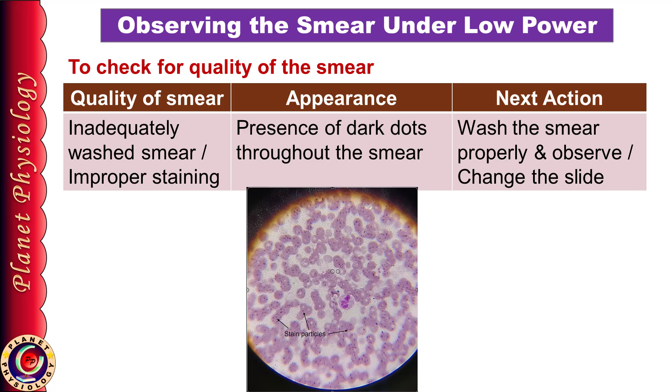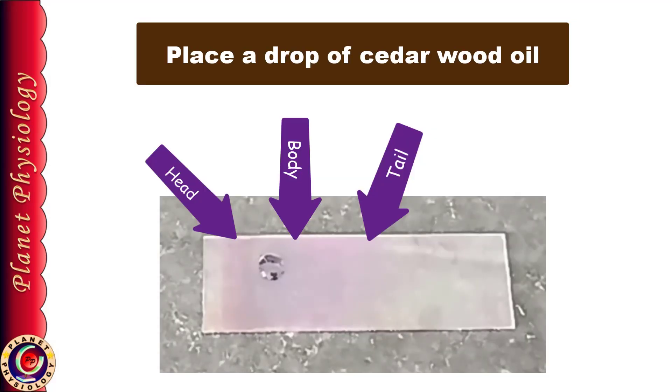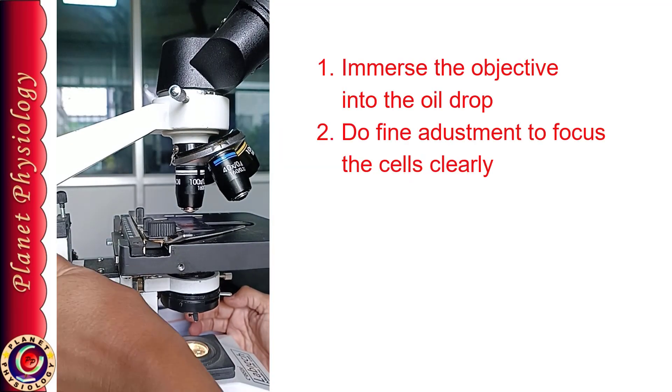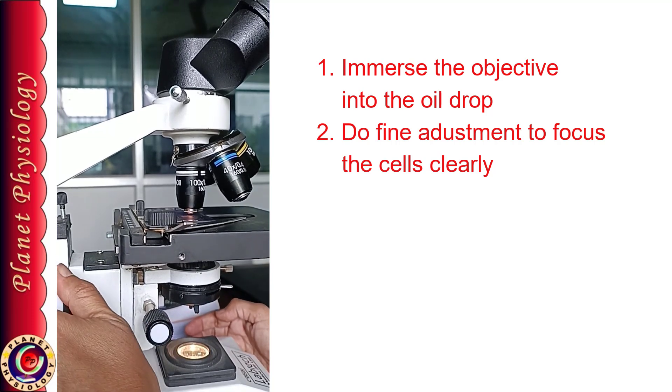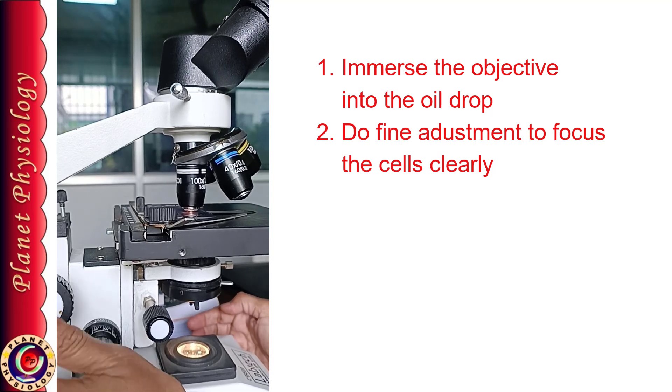If you have an ideal smear, place a drop of cedarwood oil on the body of the smear towards the head end and bring the oil immersion objective into position. See from the side and immerse the objective in the oil. Now see through the eyepiece and focus the cells using fine adjustment.